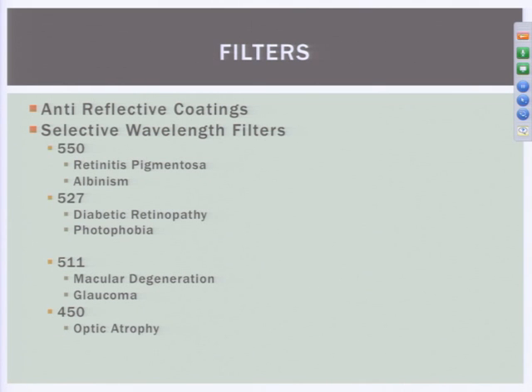Now, in addition to prism, which, as you can see, is a pretty helpful tool in a wide range of vision problems, there's also the issue of filters.